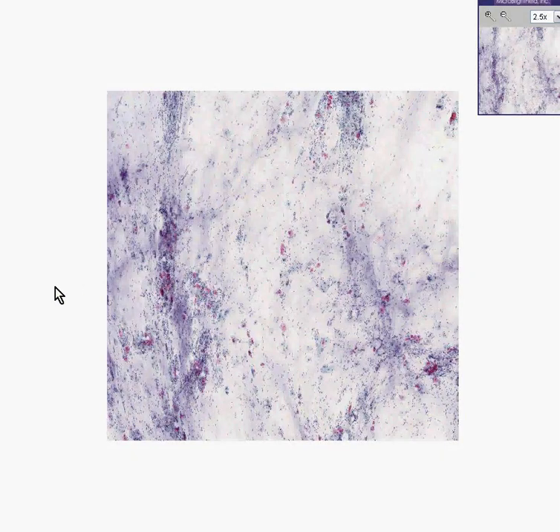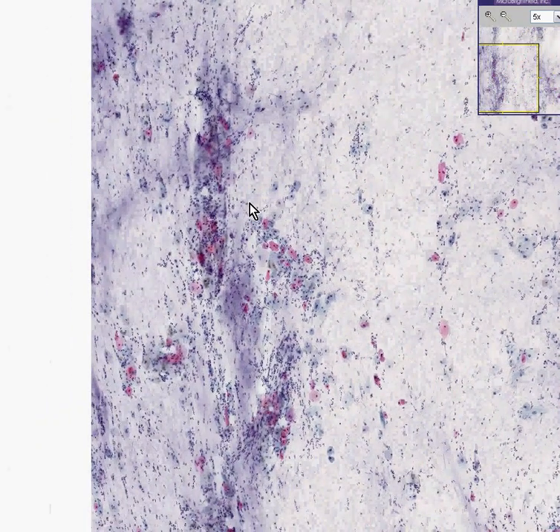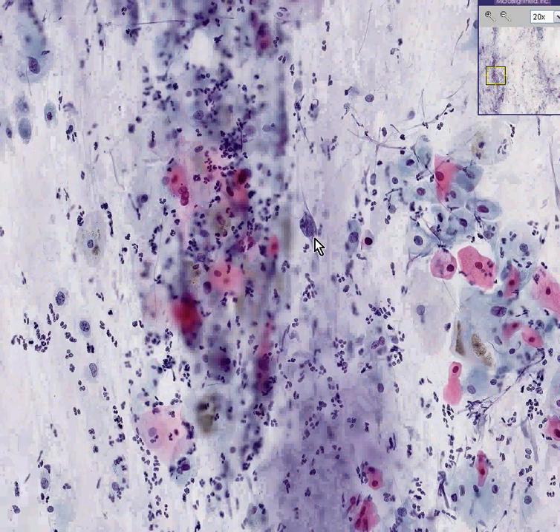This may very well be the same slide we just saw in the previous case. In fact, it looks identical. But once again, I'm giving you a couple more chances to become real experts at pap smear, and let's look at it again. What do we see here?